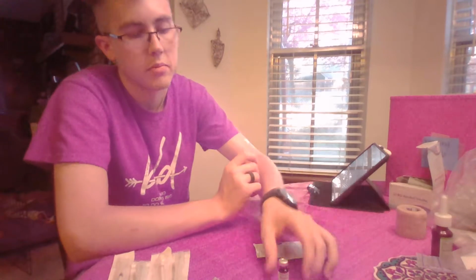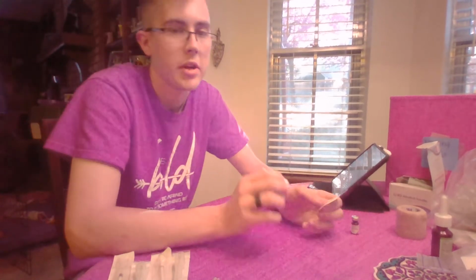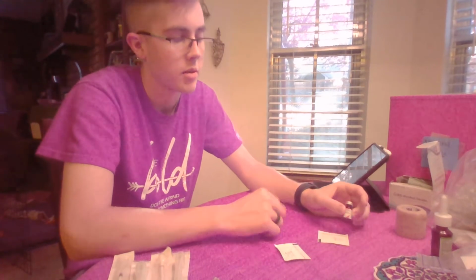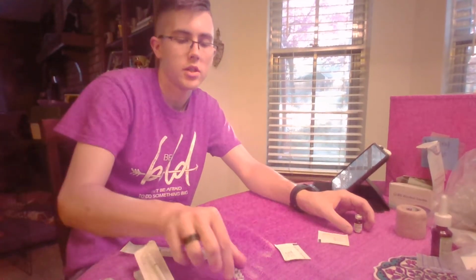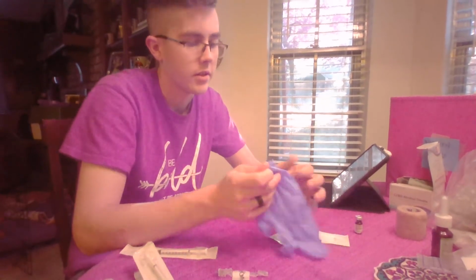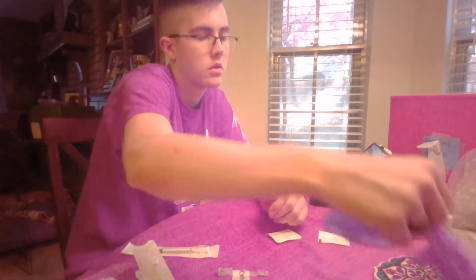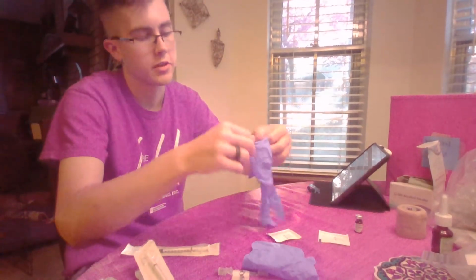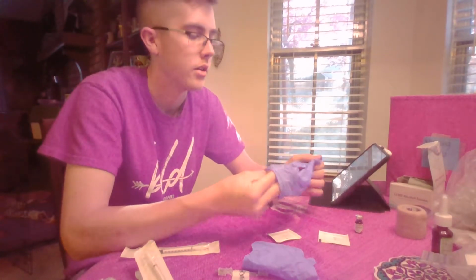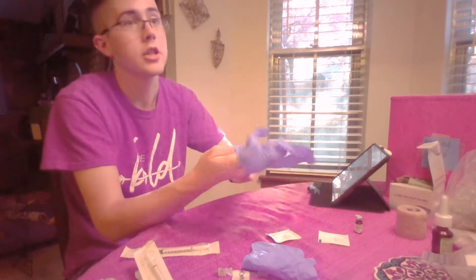So starting off, making sure to keep adequate ventilations for my patient. Next step, I'll be gathering up all of my materials, so my medication, my syringes, find my atomizer, gloves, everything else of the sort. If my patient is alert, I can go ahead and ask them if they have any known allergies. So, do you have any allergies?